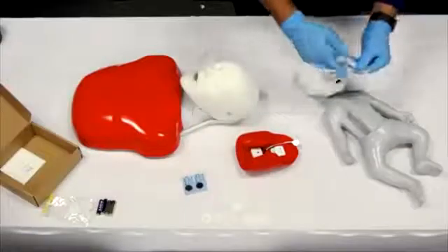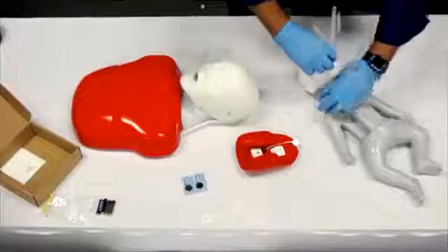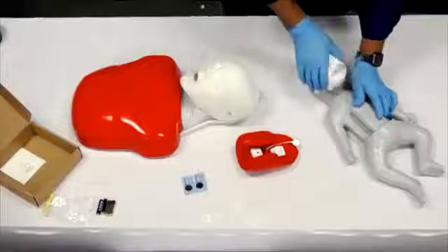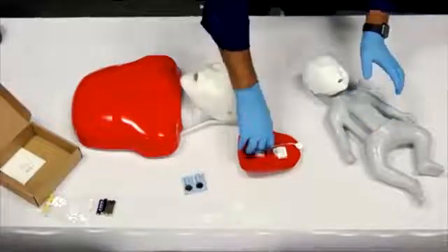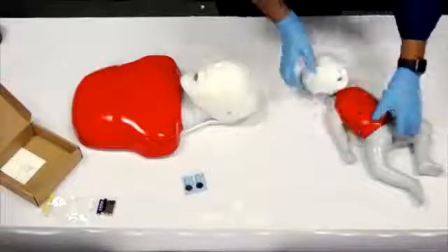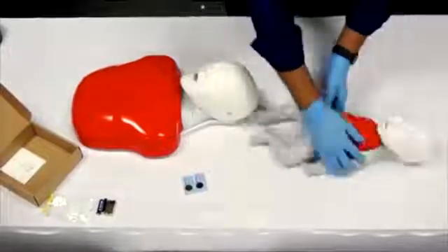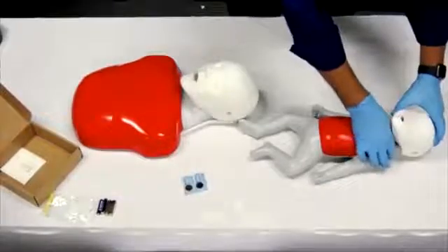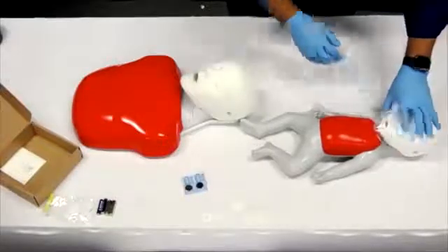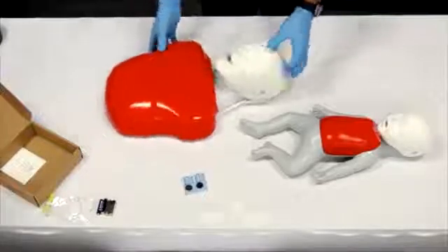And we'll go ahead and show you how to get this one set up too. So he's putting the insertion tool with the lung bag through the mouth, and you can see the bag rests right on the chest, and then you just push the chest piece over the body. You're ready to go. These are the assembly differences for Basic Buddy Plus.